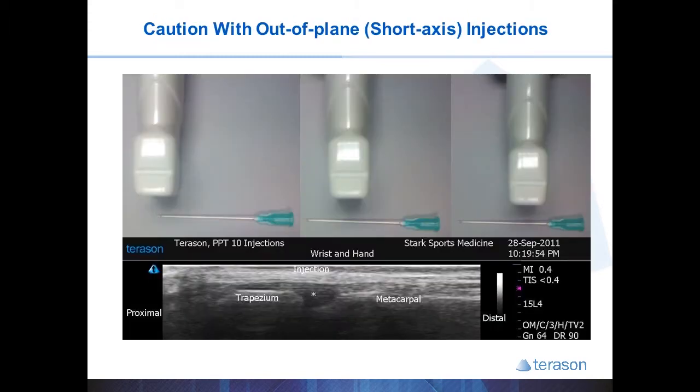The main drawback of short axis injections is that all you see on the screen is a white dot, and you can't tell whether that white dot represents the needle tip or part of the shaft of the needle. As shown in the three images, there are three very different positions of the needle below the probe, yet all three would have the same ultrasound image with only a white dot. Your needle tip may be an inch away from your target.